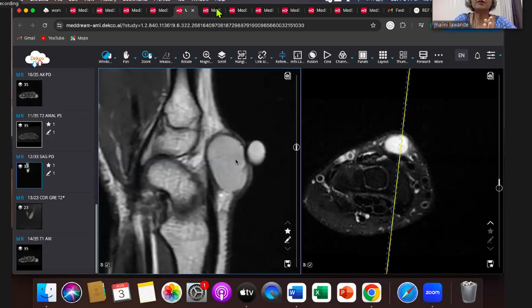So the pain marker, there are multiple types. You have these commercially available specific pain markers, but they do work out expensive. So what we use is the vitamin E capsule because it is fatty, so it would be bright on T1 weighted image. So just a vitamin E capsule, you put it there. Except I'll tell you certain conditions where you should not put it.